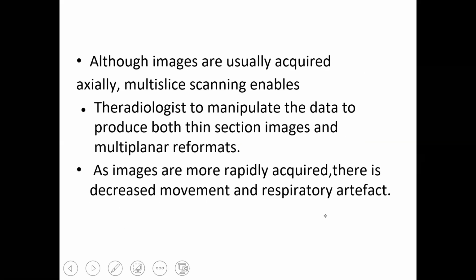Although images are usually acquired axially, multi-slice scanning enables the radiologist to manipulate the data to produce both thin section images and multiplanar reformats. As images are more rapidly acquired, there is decreased movement and respiratory artifact. So you should keep these things in mind also.